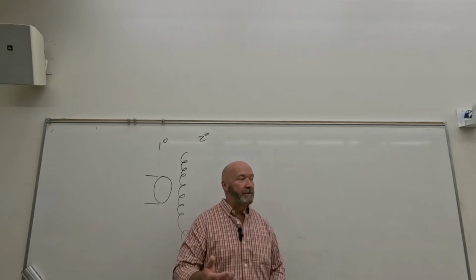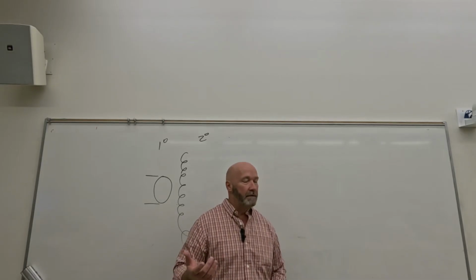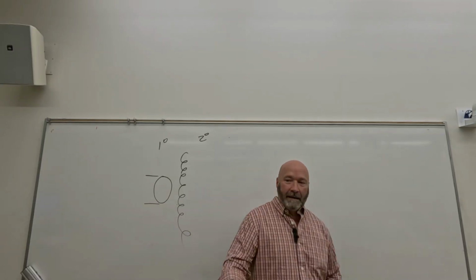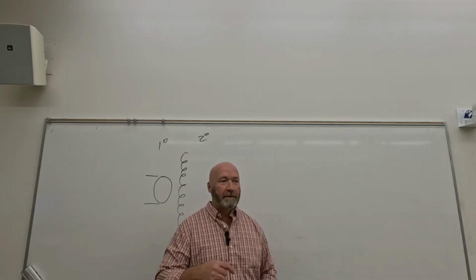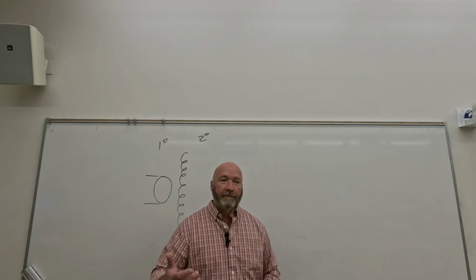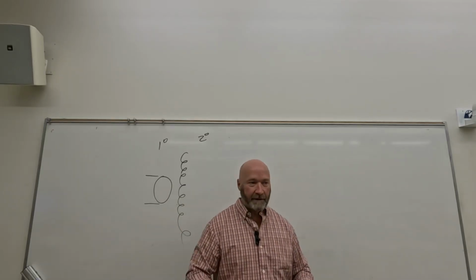In a fraction, 30% is roughly a third. So it's roughly 1/3. How much of a change in kVp do you need to double your exposure? 15%, right. So what's 1/3 of 15%? 5. So 5 kVp is enough to affect any kind of change at the image receptor.